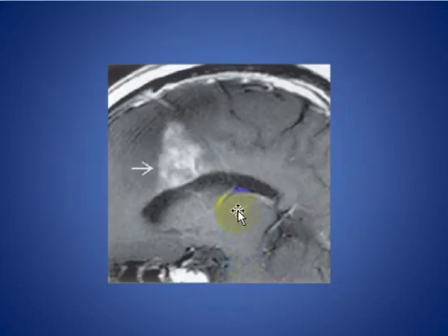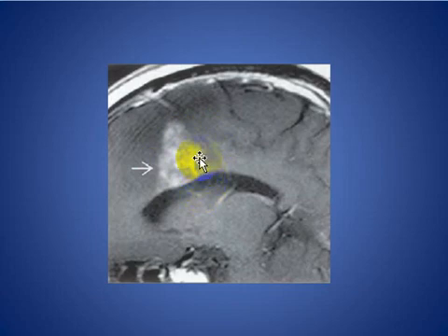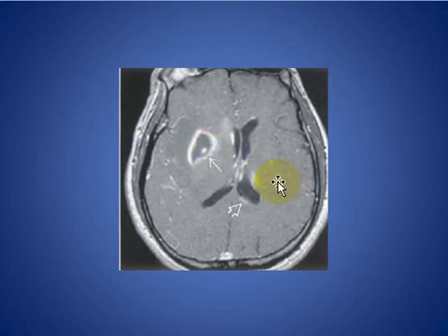Here we see a periventricular enhancing mass lesion with ring enhancement in the body of the corpus callosum extending to the periventricular white matter in a patient with AIDS. Periventricular location helps differentiate from toxoplasmosis. Another patient with primary CNS lymphoma shows T1-weighted imaging with ring enhancement.